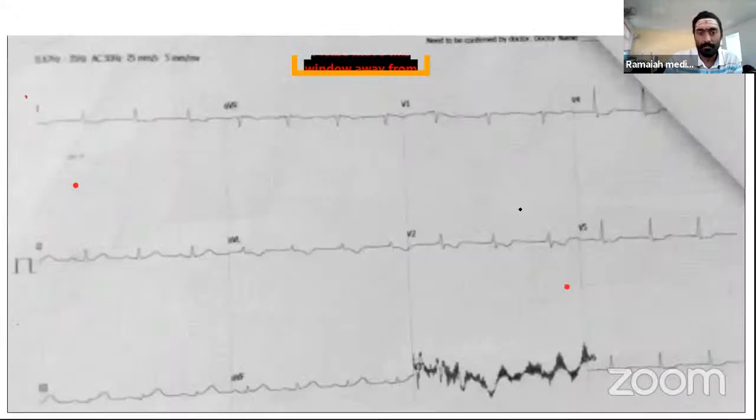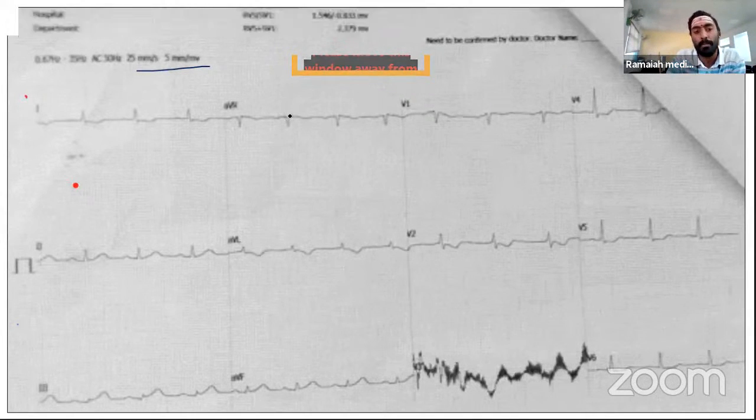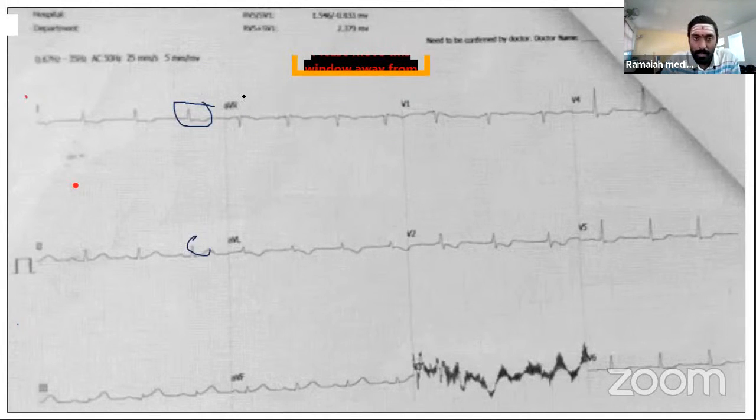We will see now. So we saw the previous ECG. Can someone tell me what is abnormal here? What is this? Half, full, double? What is abnormal in this ECG? Correct, correct, correct. So it is half standardized. Very good. So because it is half standardized, how is the QRS complex looking? It looks very small. It has to be exactly double of this, but still it is appearing half of it because of the standardization. So this is the effect of standardization.